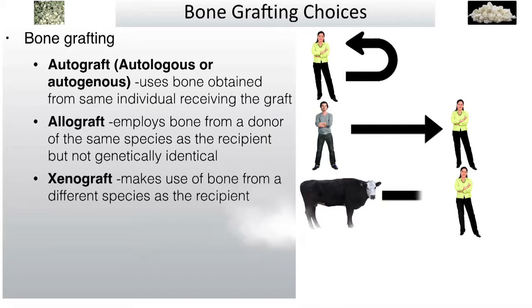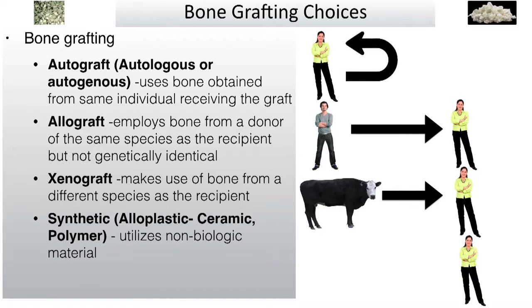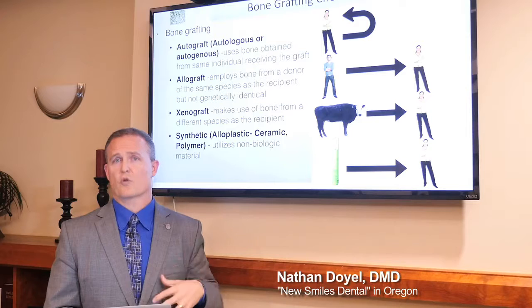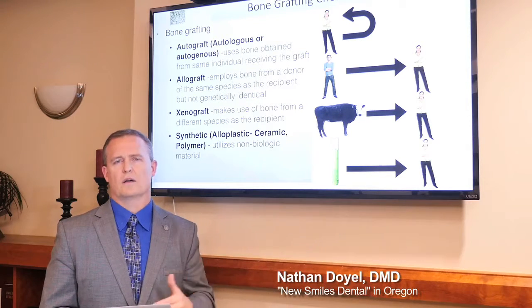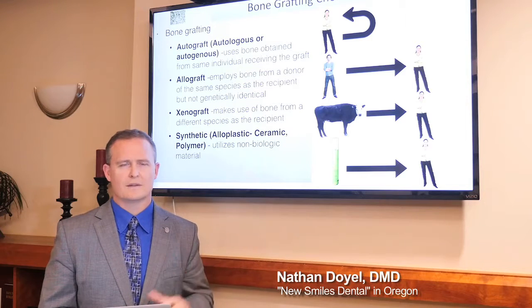like a bovine bone. It could be something from another animal that's been prepared for human use. And then synthetic. And typically, as you go along here, in these different areas, the time of resorption increases. So if you have an allograft and you're using cancellous bone, that's going to resorb faster and turn over faster. So if you want to have a situation where you want the bone to turn over quickly, you're going to use a cancellous bone. If you want to go slower, you use a cortical bone. And a lot of the xenografts are cortical bones, so you're going to have it stay around longer. And so you might choose that for somebody who's not going to have an implant right away.